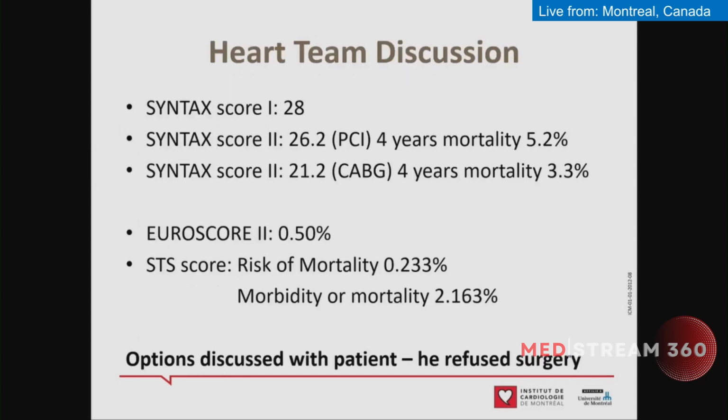For this case last week, we first discussed with the patient the potential for bypass because he had quite important disease. He is 60 years old, but he has no diabetes, and the LV function is normal, with an ejection fraction of 60%. Bypass is a good option, but we had to understand the risk-benefit. So we just did a diagnostic and brought him back to the floor. The surgeon saw him, but the patient twice refused to have the surgery.